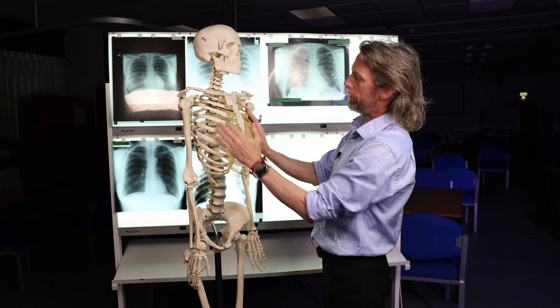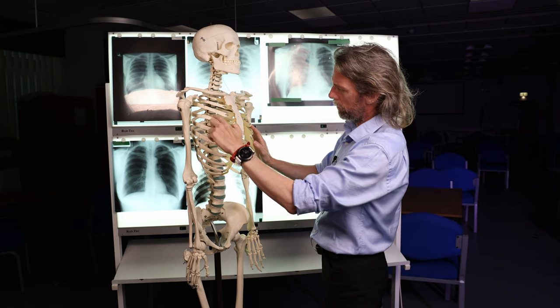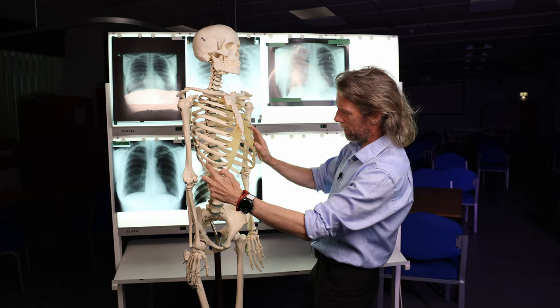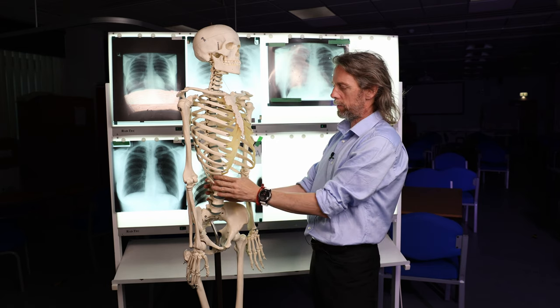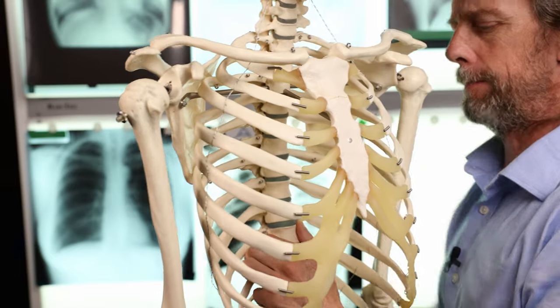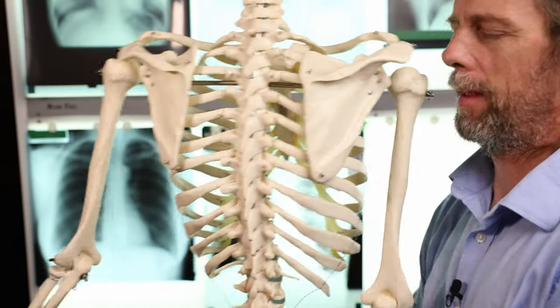The ribcage — how many ribs are there? One, two, three, four, five, six, seven, eight, nine, ten, eleven, twelve. The twelfth rib — little floaty guys down here — some people actually don't have them, but you can expect to find 12 ribs on the chest x-ray.